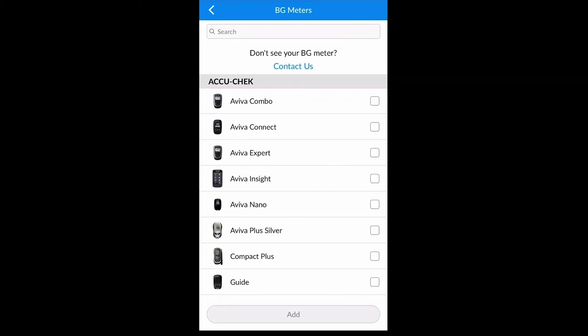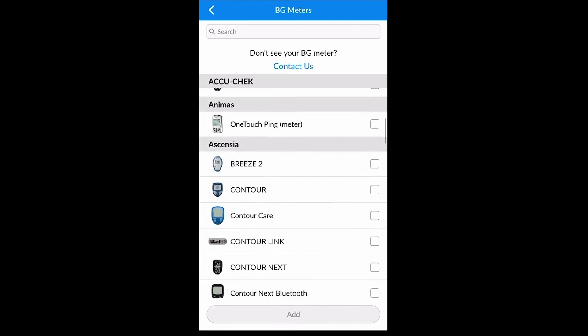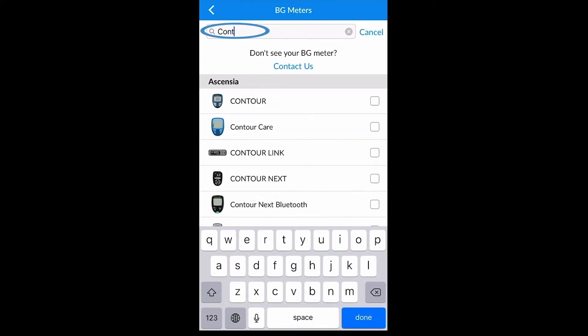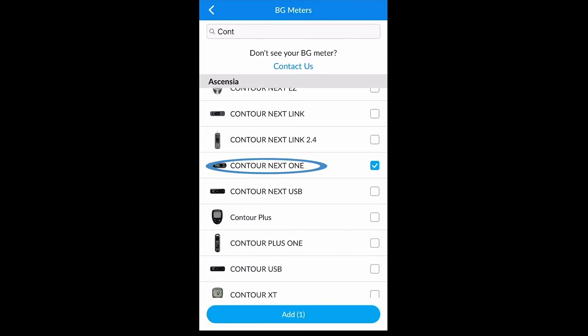From this screen you are able to scroll through compatible devices to select the device you would like to upload. Alternatively, you can use the search function at the top of the screen to search for the device that you would like to upload. Once you have found that device, select it and click add.